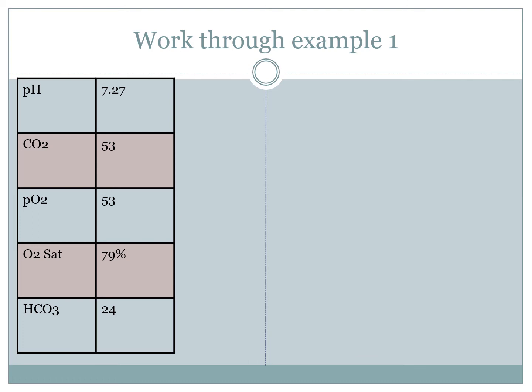So I want you to train to focus on these 5 values to do your 6 steps in order to give a good handover of the patient's status. You master that first, then you can move on to understanding the full science and really looking at the physiology behind blood gas analysis.